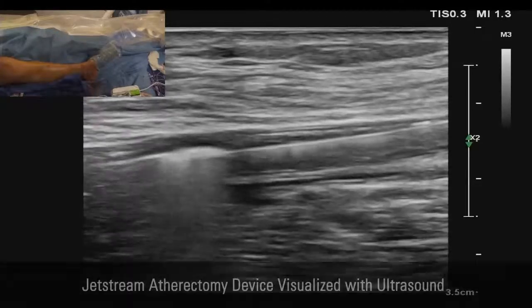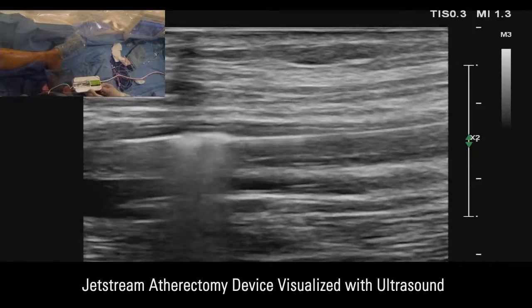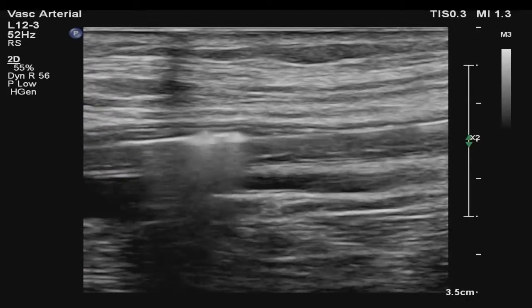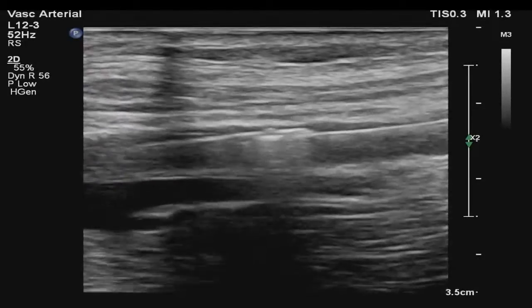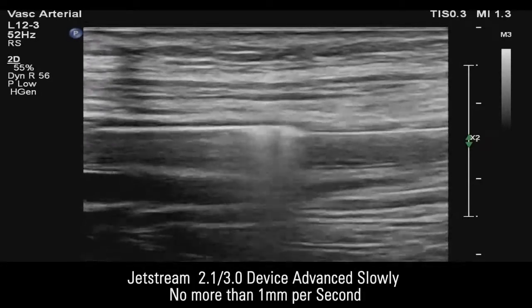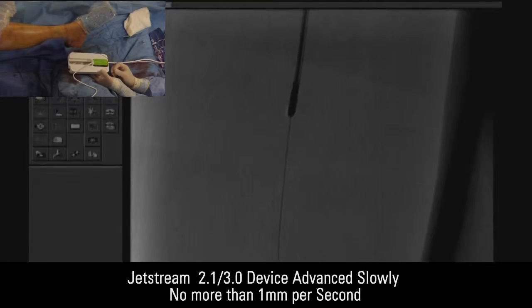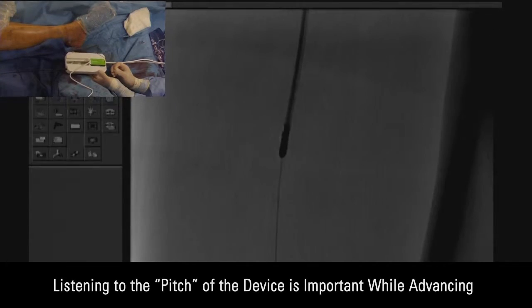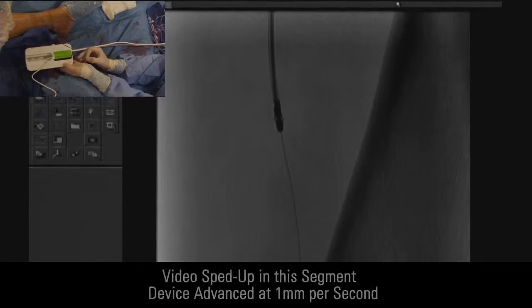Moving on to our atherectomy modality — in this case we chose aspirational atherectomy. Under ultrasound guidance, we're advancing the JetStream 2.1 device with the blades down. I'm choosing to move the device slowly. I am listening to the pitch of the device. If you feel the device is bogging down — the RPMs decreasing because of the device being overwhelmed with the amount of plaque or clot — you don't want to force the device. You want to wait and allow it to move slowly.